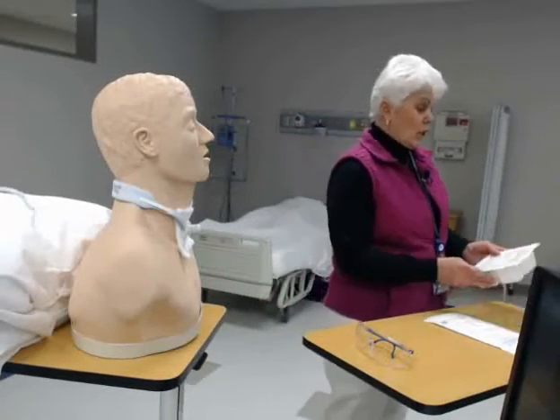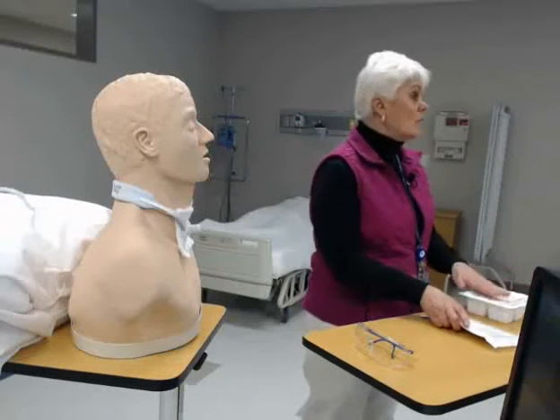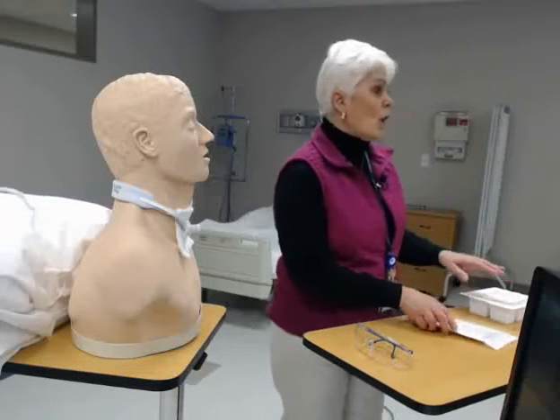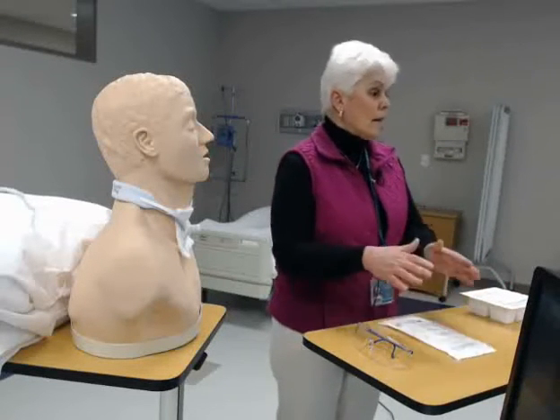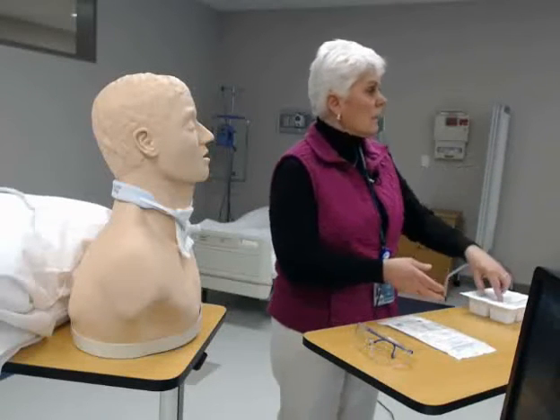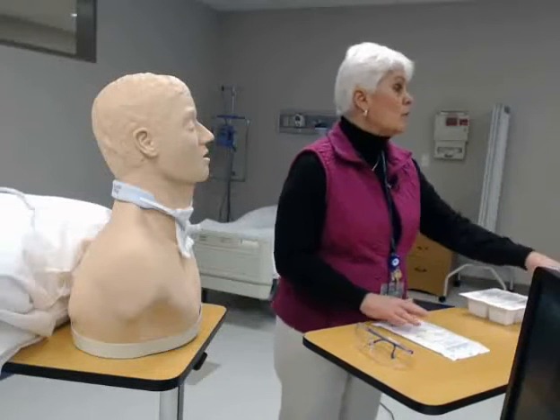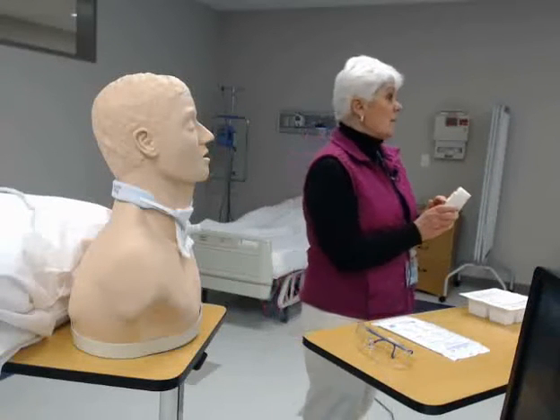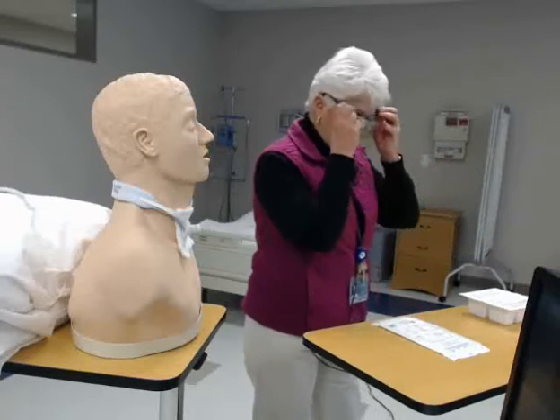Then you're going to get your supplies ready. You'll have a tracheostomy care kit that contains sterile gloves; however, they're challenging to keep sterile. I get my own sterile gloves that are flat and easier to put on. I also have sterile normal saline with a date, time, and initials — I opened this two hours ago. I have goggles which I'll put on now.